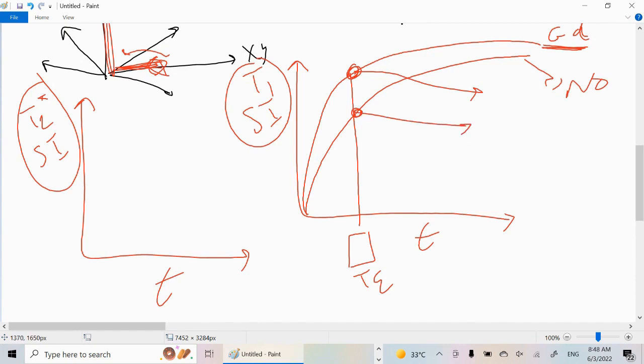However, in a high-resolution T1 weighted image, like in spin echo imaging, in the first pass you want to see the blood flow, which is referred to as the first pass. This means that my contrast agent is still moving through the microvessels, and you want to observe its blood flow or perfusion within the tissue to differentiate the blood supply between the different areas present in the brain or whatever organ you are working on.